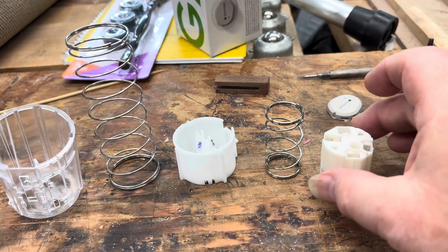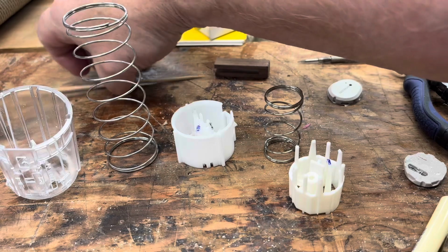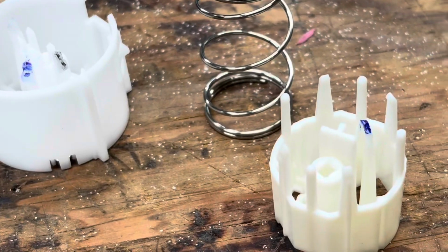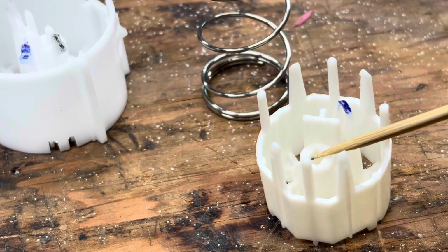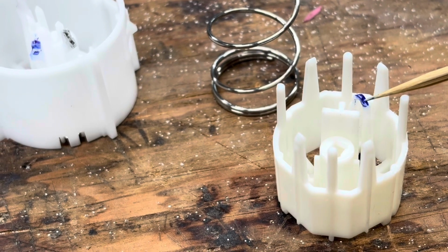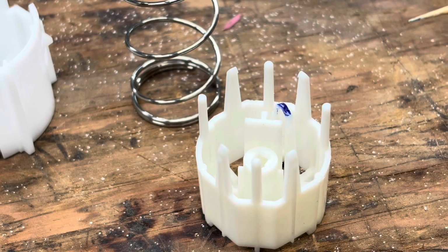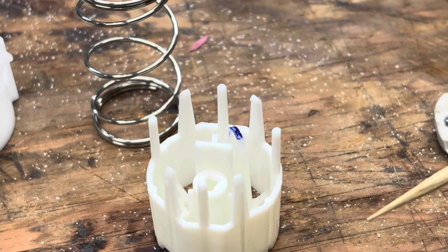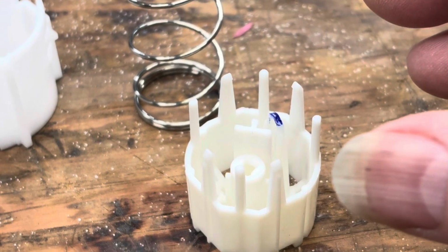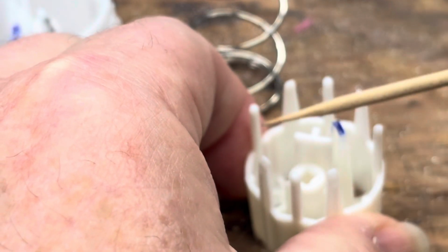Go through these in reverse order. Cup 4 holds the needle. Let's see if I can expand this a bit. Cup 4, this platform holds the needle. This blue arc is the locking mechanism to prevent the needle from injuring the patient once it's been fired. There's a T mechanism to keep all the parts aligned. All these fingers are what holds the probe, the device, in place.